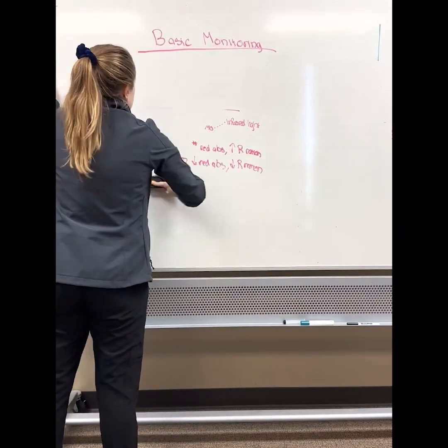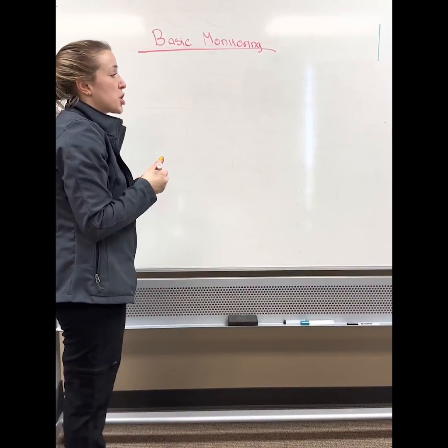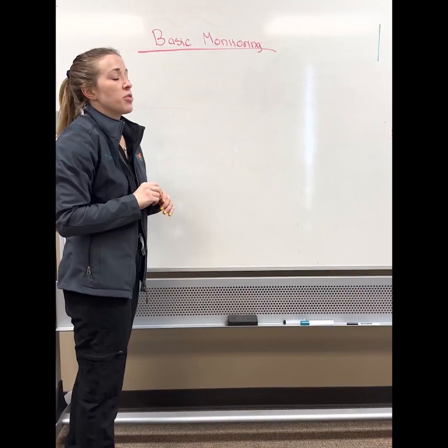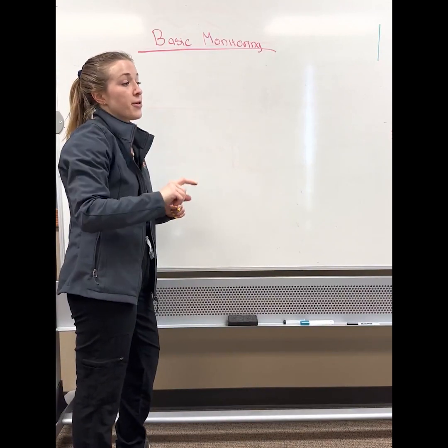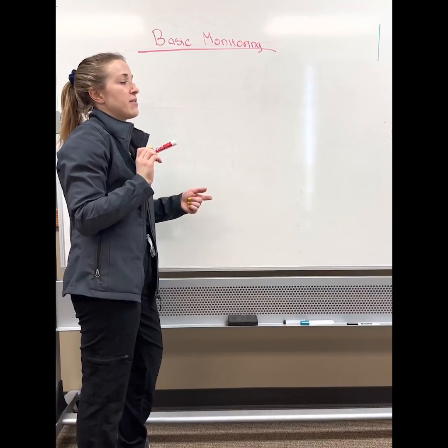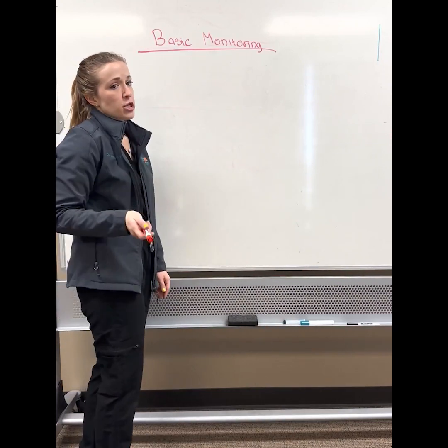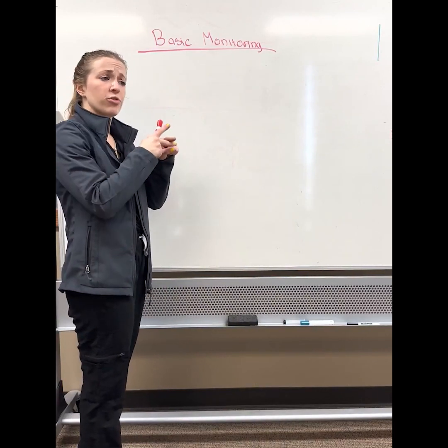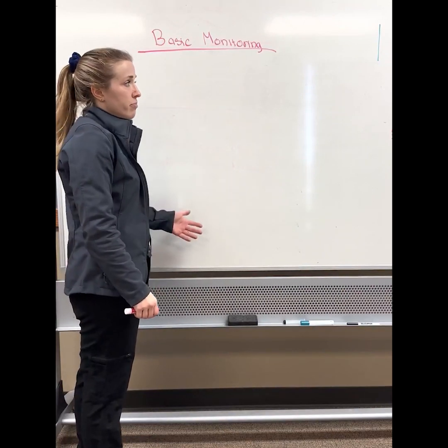So here are some other things I can say about pulse oximetry. Pulse oximetry in general, kind of like ECG, is prone to artifact. The pulse oximetry is read based off of pulsatile blood flow, right? So if the reading of the light absorbance is interrupted by a disruption to flow or by something else, then your reading is going to be artifactually low. For example, if your patient is very cold or vasoconstricted, sometimes the pulse oximeter has a difficult time reading pulsatile flow in the periphery. So sometimes it gives you an artifactually low reading. There you go.